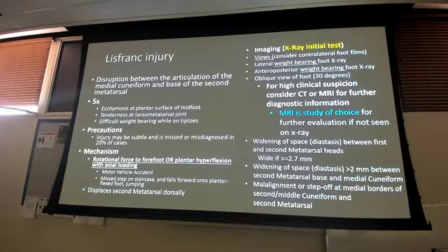So this is dorsiflex, this is plantar flex, and I add axial loading on it. It's a weird position to be in. Usually we'll see this with running, kind of stepped in a hole I didn't see as I went to plant my foot, hit, twisted, fell, right? That kind of stuff. Motor vehicle accidents are common. Step on a staircase, falls forward, plantar flex foot, all that. What it does, it displaces the second metatarsal dorsally.